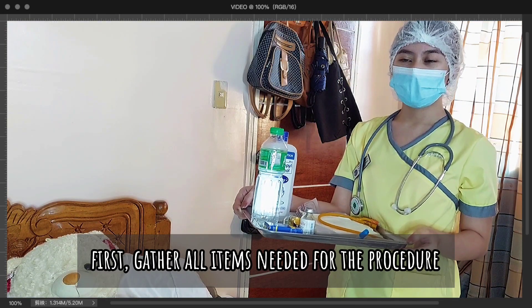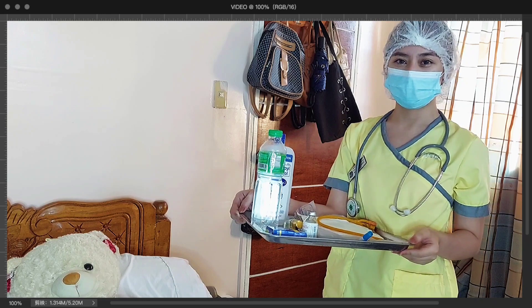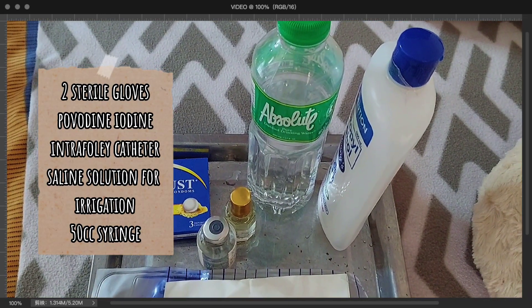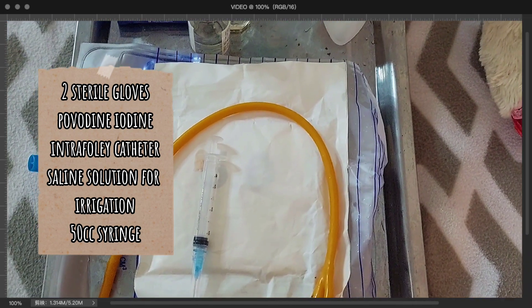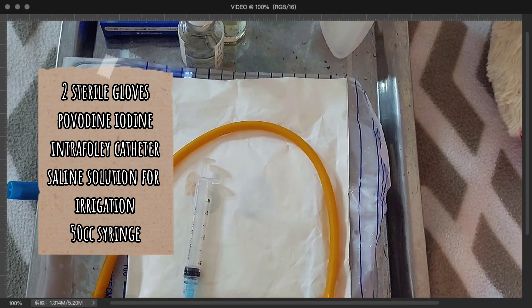First, I will gather everything needed in the procedure for easy accessibility. We have two sterile gloves, povidone iodine, a Foley catheter, saline solution for irrigation, and a 50cc syringe.